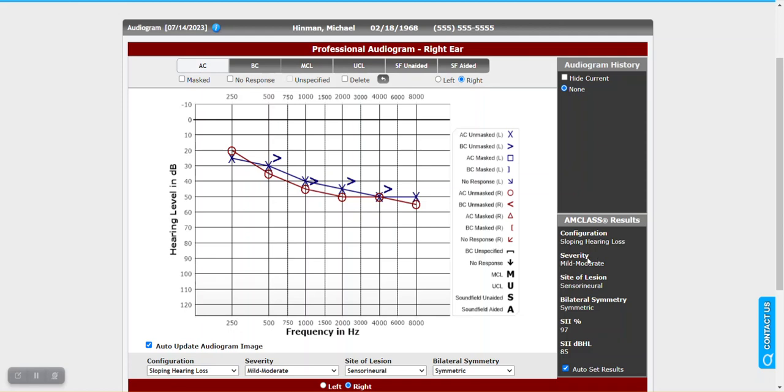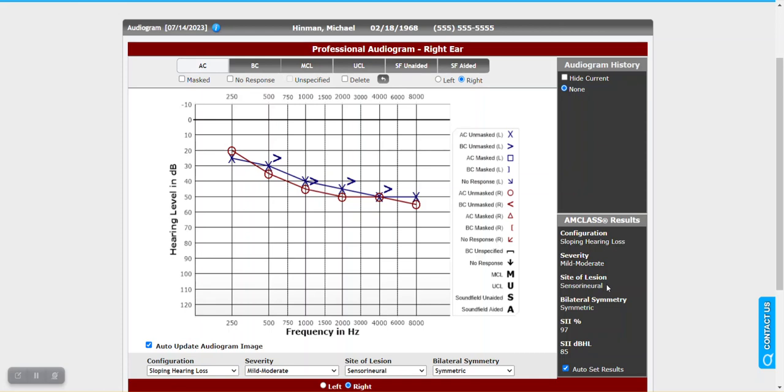So if as you are entering the test data directly into Counselor, you note that some of these classifications haven't occurred yet, that's because the data hasn't been entered. So if you haven't entered your bone conduction thresholds, well then site of lesion cannot be determined. And if you have instances where you're testing and you can't get bone conduction, for example, that is perfectly fine. I'll show you in a moment how you can still enter this selection without AMCLAS having detected it.